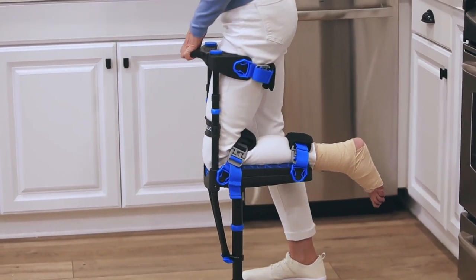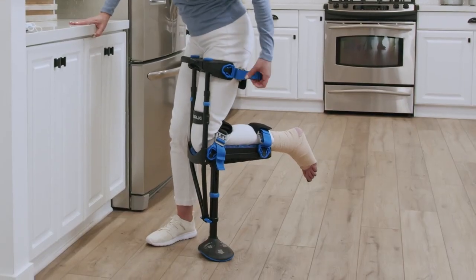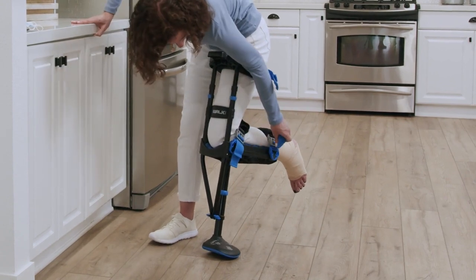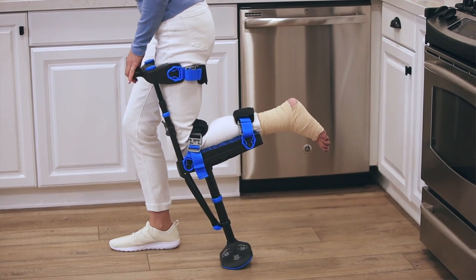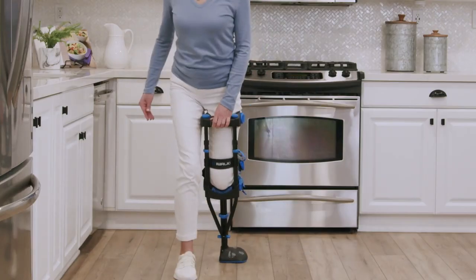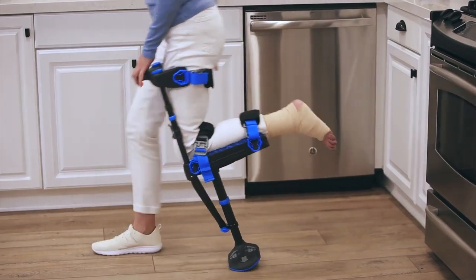Now it's time to try walking. First, check to make sure your straps are still fully tightened. Repeat the exercise and when you're ready, instead of stepping back, continue walking forward. Keep your hand on the handle and remember to put the majority of your weight on the iWALK side.